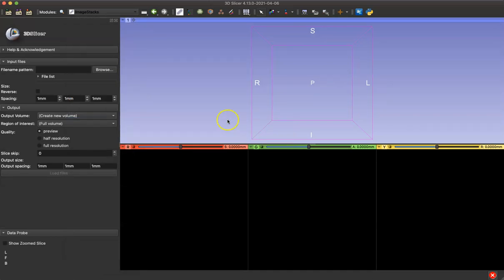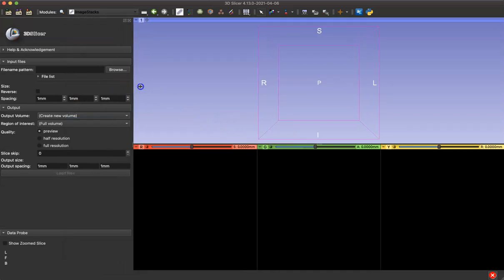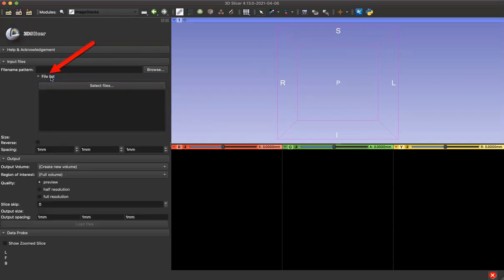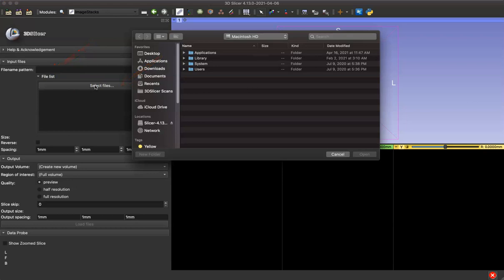I'm going to widen my menu here so you can see the options a little bit more clearly. Click on File List and then select Files. From here you'll want to find the folder storing your TIFF files and open it.